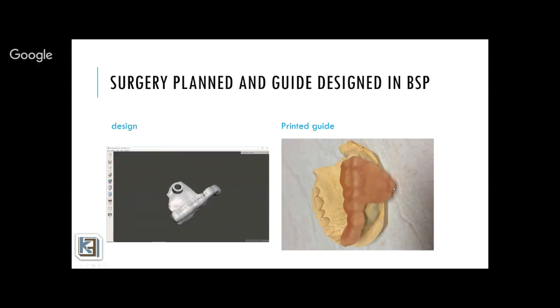almost as if you're taking it for a denture with border molding, because the apex of the root is somewhere up there, and you have to reflect your flap all the way up, and so you can slide your surgical guide up there. So basically what we do is we create the surgical guide with an implant or a custom implant pointing towards the apex of the tooth. So you design it in the software, and then you create the guide and you print it.